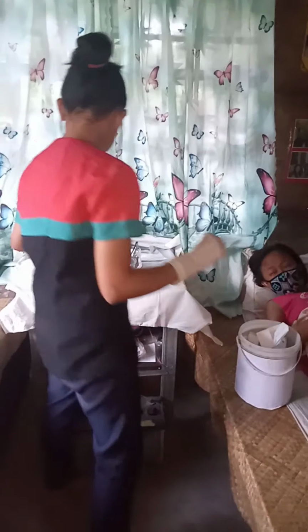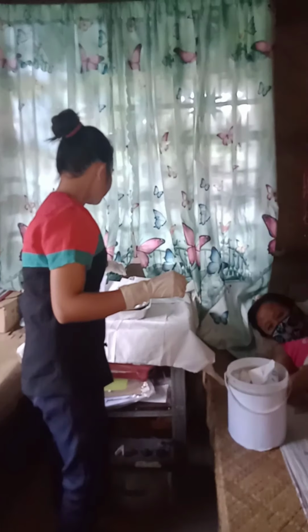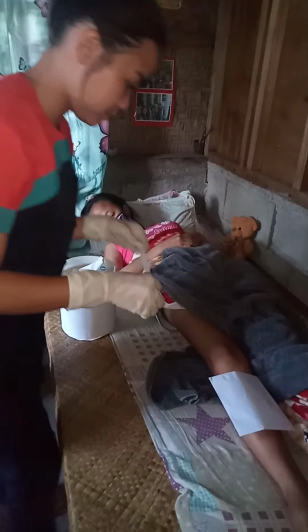Then apply the second layer of gauze. And lastly, it is the time to put this thicker woven pad. We also need to tape it. Make sure to tape it carefully.